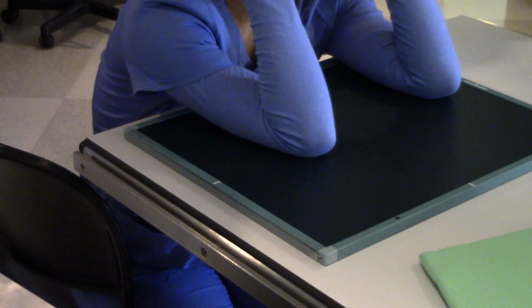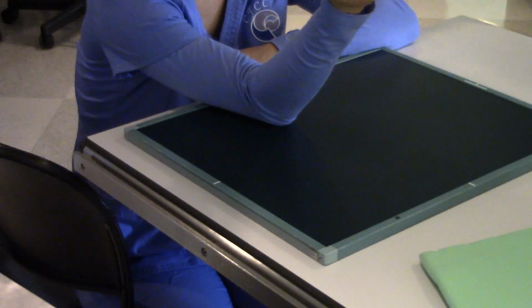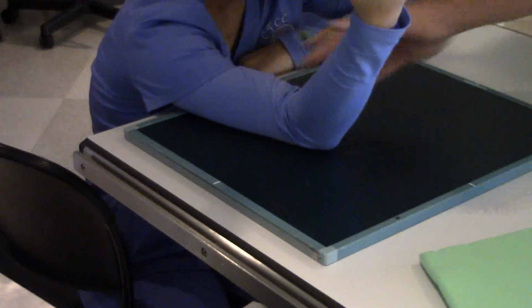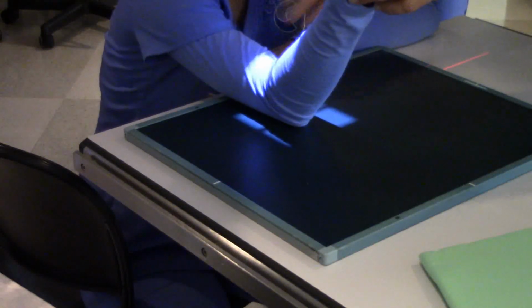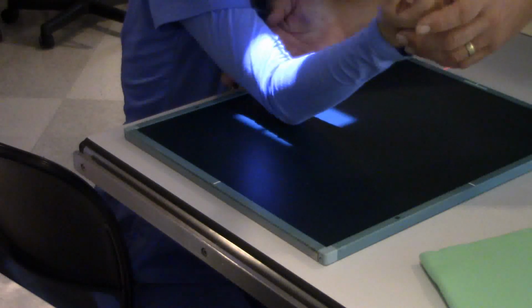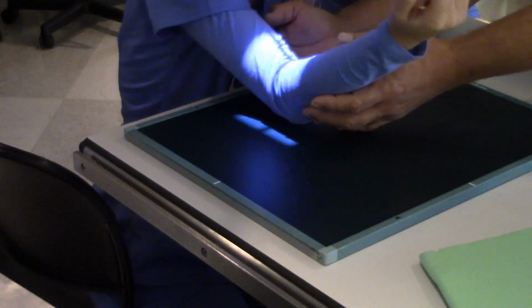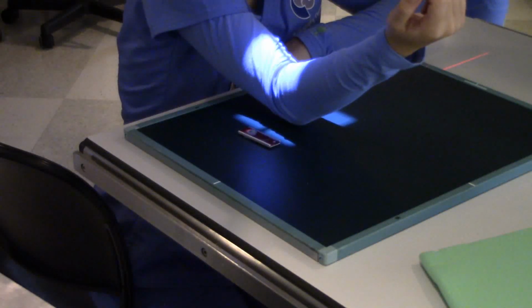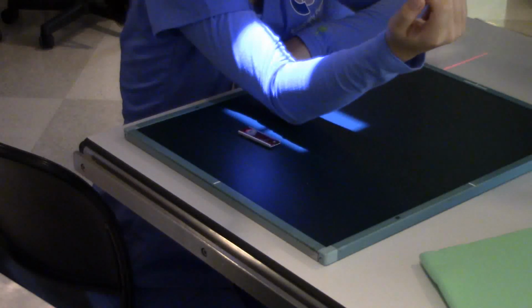So, like if Abby, okay, Abby, get in the position. If she's like, instead of putting her humerus all the way down like this, what we might do is, okay, ma'am, I'm going to get you to kind of, there you go, like that. Now I've got an angulation here and an angulation here, but those are about even. So I'm just going to do that and shoot. And this is like adaptive radiography.